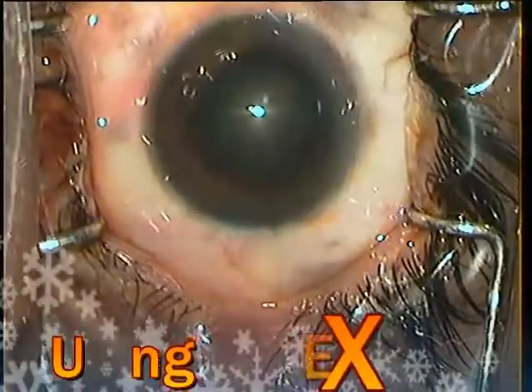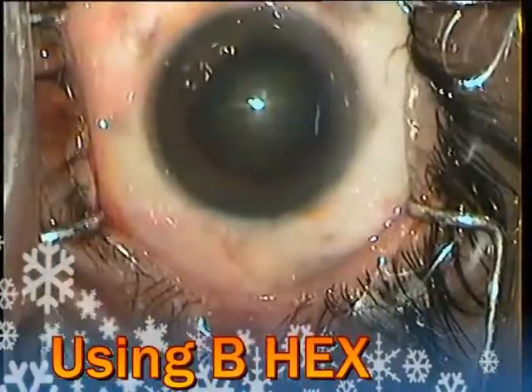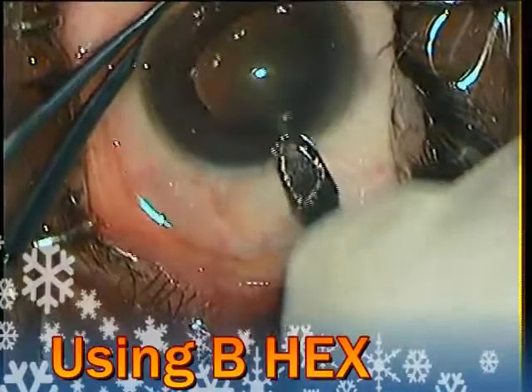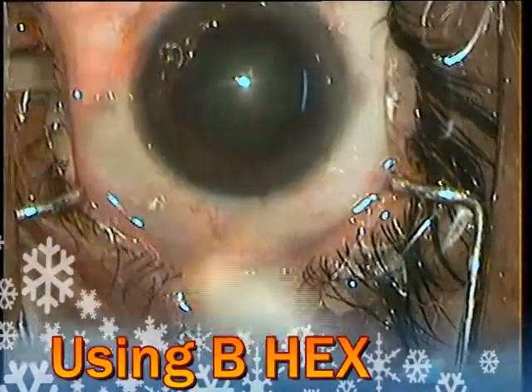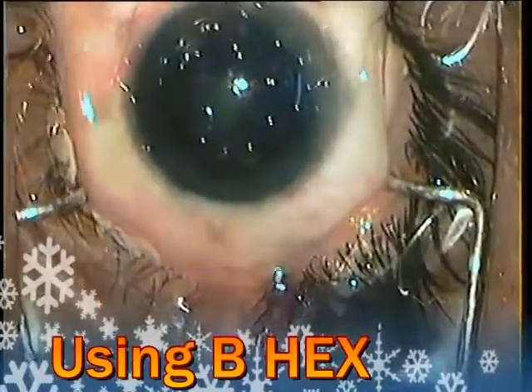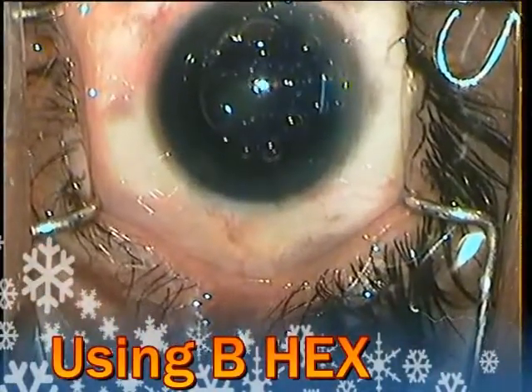Dear friends, in this case I shall be showing how I used the B-HEX ring in a semi-dilated pupil. This is my second case. In the first case I was not very successful and so I am trying it again in this case.